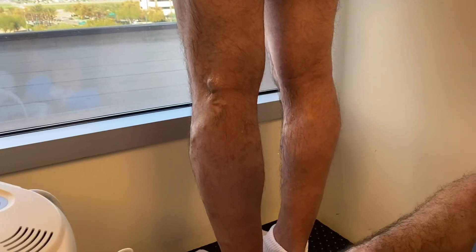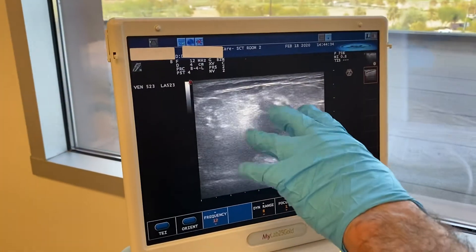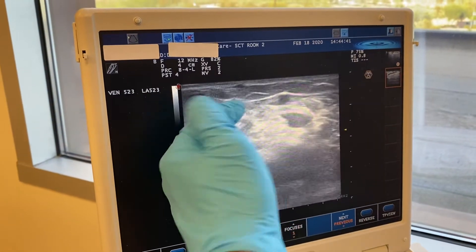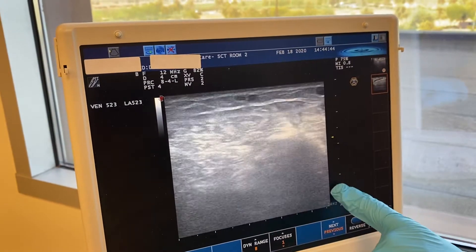I'll show you on the ultrasound here what it consists of. When we're imaging the back of the popliteal fossa, this is actually the short saphenous vein here, and the short saphenous vein is fine — you look at it, go down, it's small, it's not refluxing.